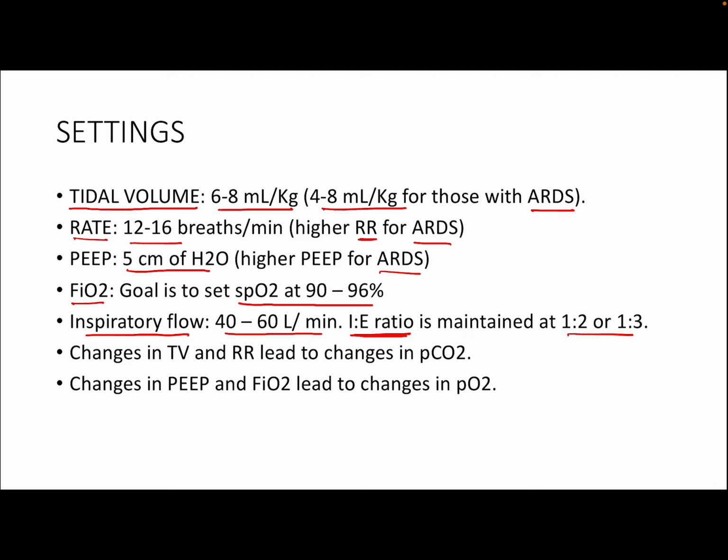Here I would like to point out a concept. So in case of COPD, there is essentially airflow limitation, so that the patients with COPD have difficulty in exhaling air. The time taken to exhale is actually more. So in these patients, what we prefer to do is we increase the inspiratory flow rate. So if the rate is increased, the time spent in inspiration is decreased. So the time that could be spent in expiration in the total time can be increased, thereby giving them more time to exhale all that air.